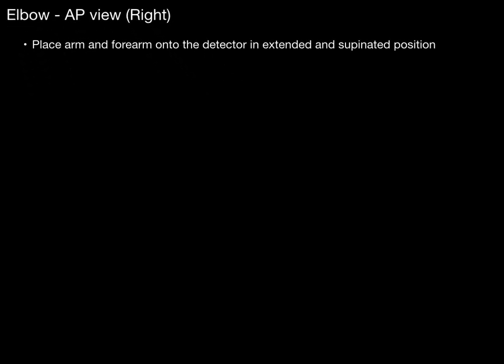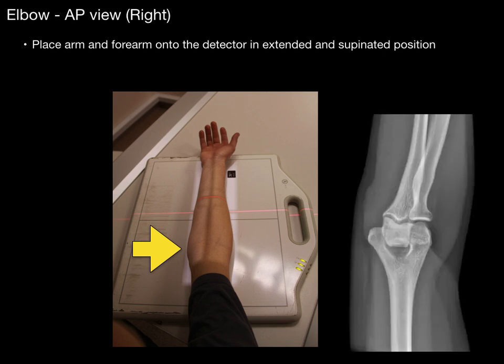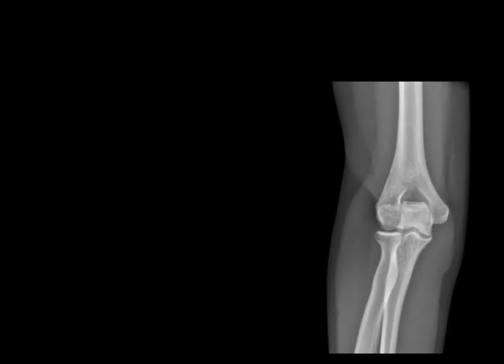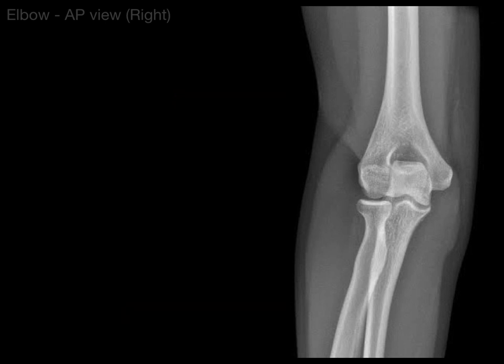First, the elbow AP view on the right-hand side. We're going to place the arm and forearm onto the image detector in an extended and supinated position. You can see where the light around the side is where the picture is going to be taken. We're going to turn it around and blow it up a little bit — that's the view we're going to be taking a look at.